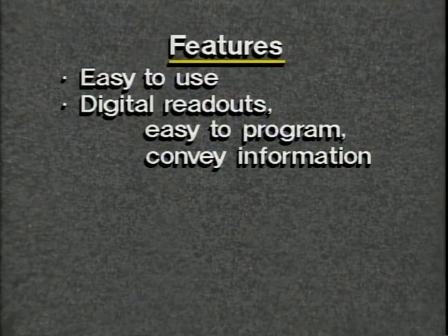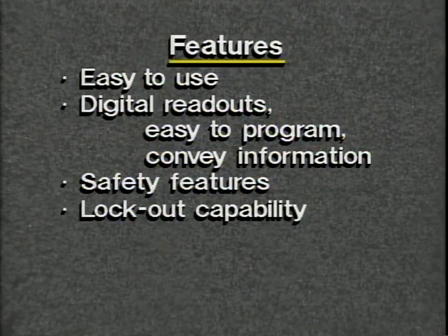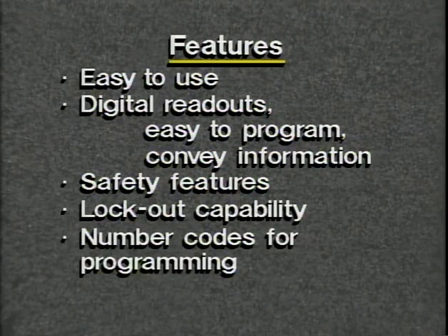Programming the pump, entering the information needed to maintain the infusion rate, is as simple as programming a VCR or microwave oven. The digital readouts also communicate vital information to the nurse or caregiver, such as the rate of infusion and medication administration. The pumps have many safety features. These features guard against disconnections and accidental free flows, that is, solution running into a vein uncontrolled. Some pumps offer the lockout capability, so the child or confused patient cannot change the settings. Others, like the patient-controlled analgesia pump, have number codes which permit only the nurse or physician to program the pump.